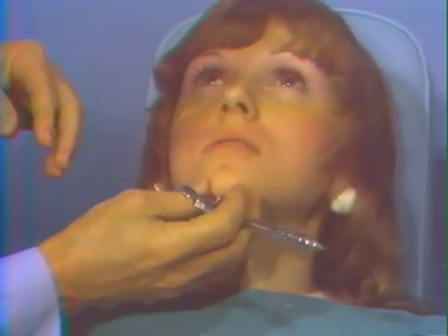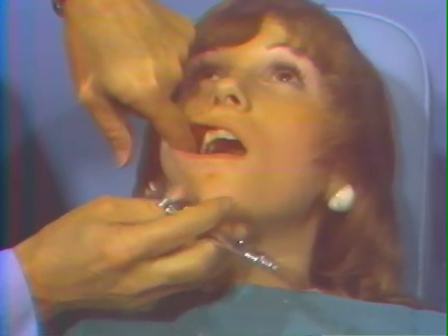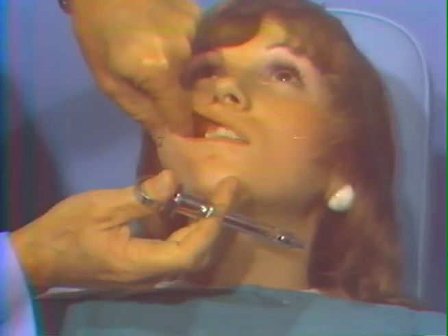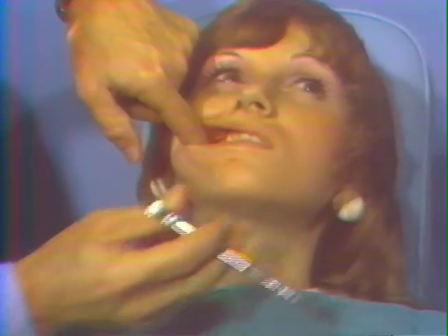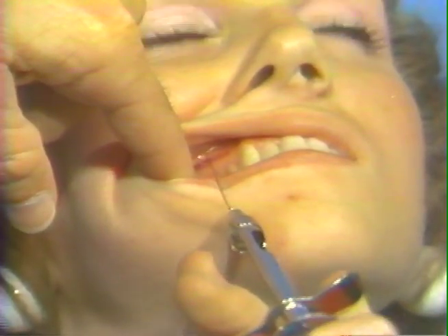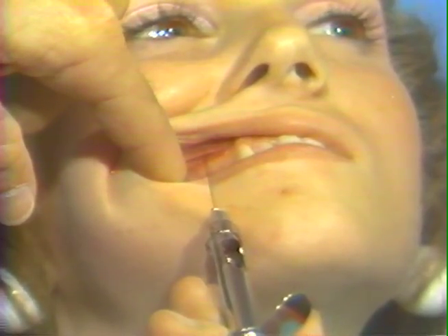Tip your head up just a little bit. Open your mouth a little bit wider. Let me pull your cheek to the side. Don't let me turn your head. Retract with the finger mainly in this position. Turn a little bit to your left. For the middle superior alveolar nerve in the area of the bicuspid teeth, the right injection by placing upward into the mucosa to the height of the apical area of the tooth.